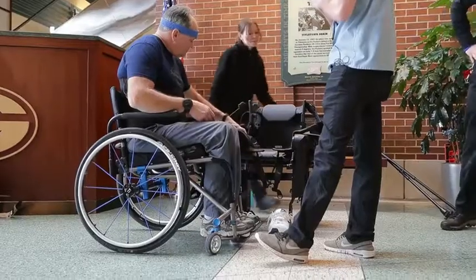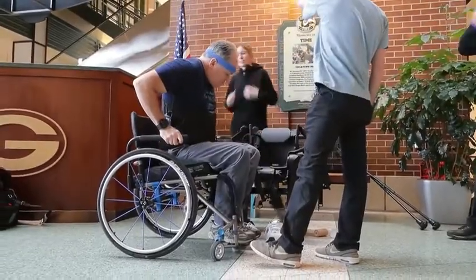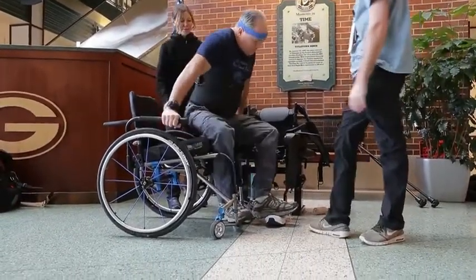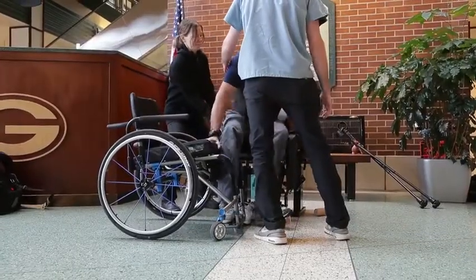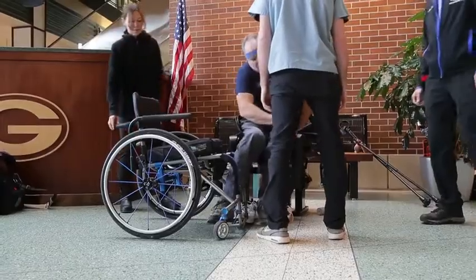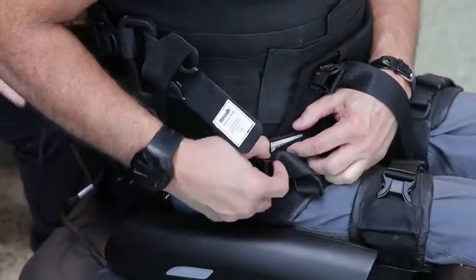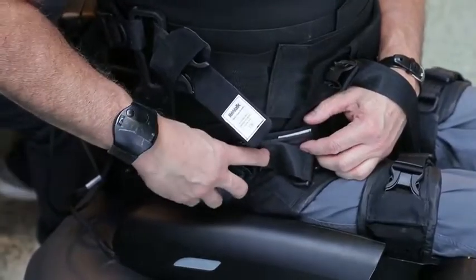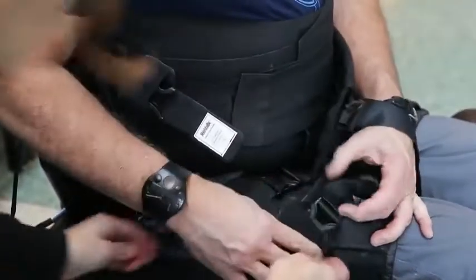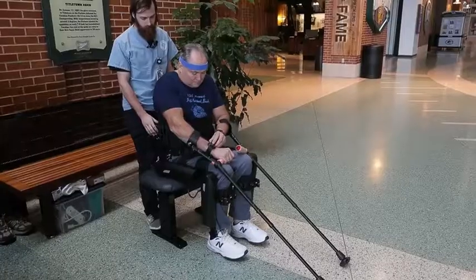With this study we basically want to see how useful these devices are in the community. We have a screening phase where they go through a lot of tests and measures, and then we do a training portion. Ideally, the participant takes the device home for four months and gets to use it in their community and home — because they're really nice and flashy, but we want to make sure that veterans are actually using them so we can get them what they need.